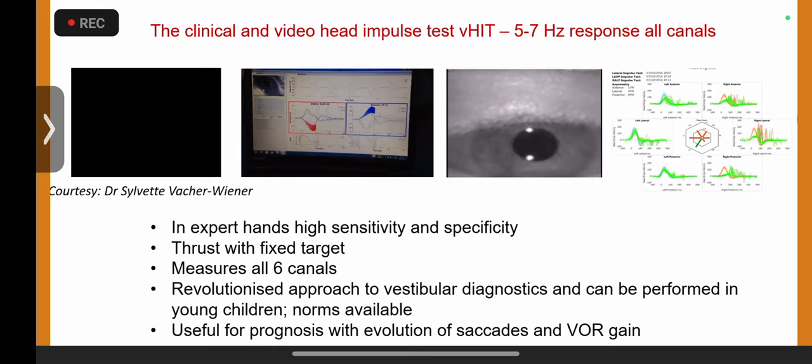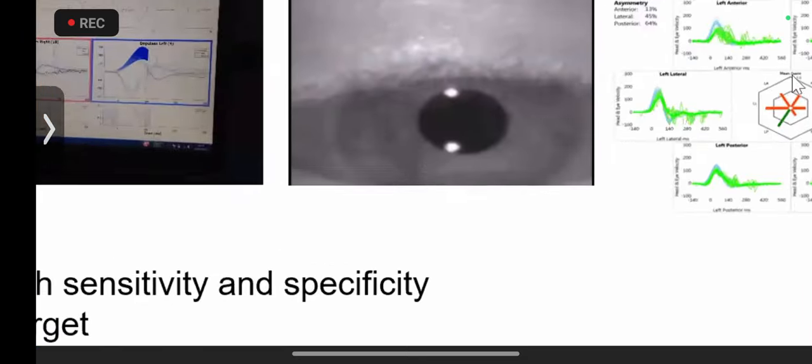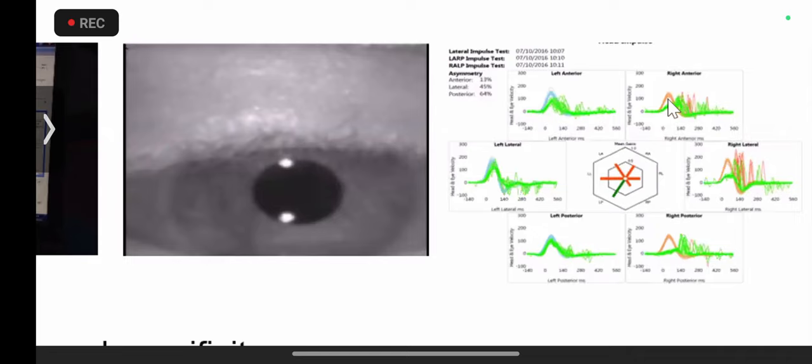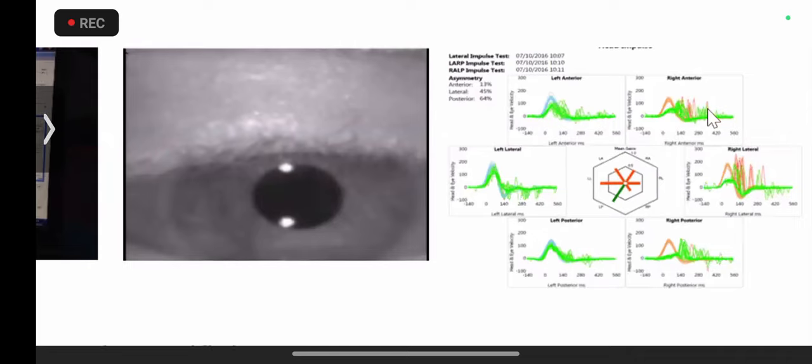This is the V-HIT trace on the left side — completely normal. When the eye moves with the head on the opposite side, that ratio is called the VOR gain. You can clearly see the eyes moving with the head; the blue is the head, the green is the eye. However, on the right side, they are not moving together — there's a lag compensated by spikes we call catch-up saccades.